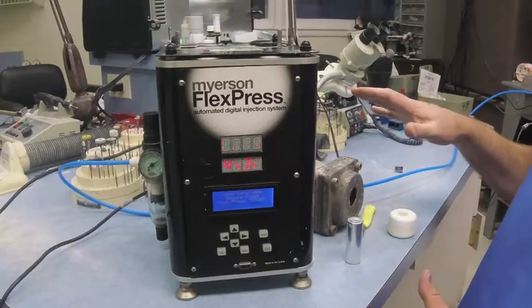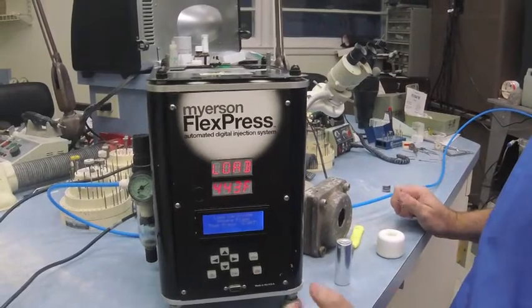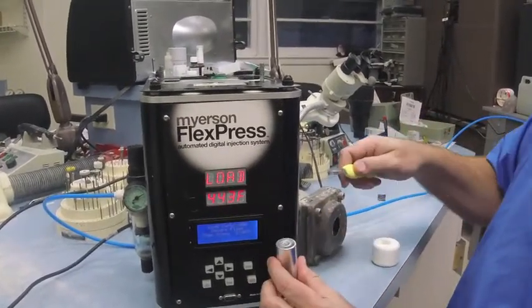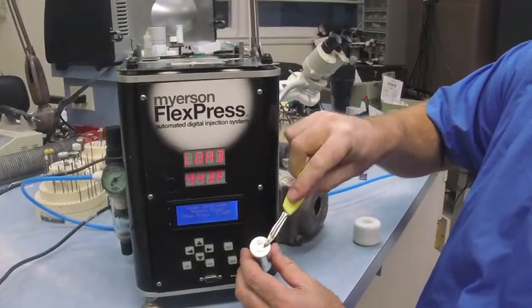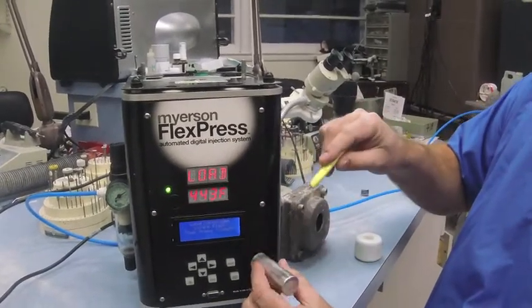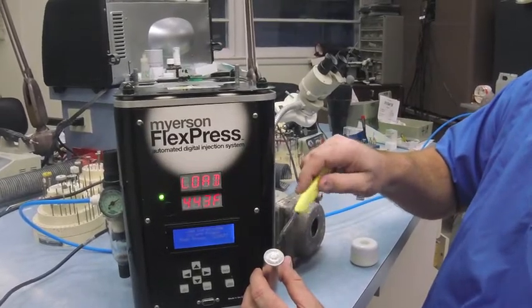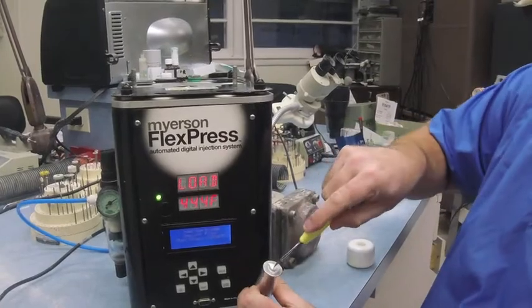Now we're going to read: load cartridge, secure flask, then press start — that's exactly what you're going to do. Take your cartridge. First thing we do with the scalpel blade: there's an indent. You can see the circular indent. On some tubes you may come across, that may be on the bottom — just wherever that indent is, take your scalpel blade and slice an X.